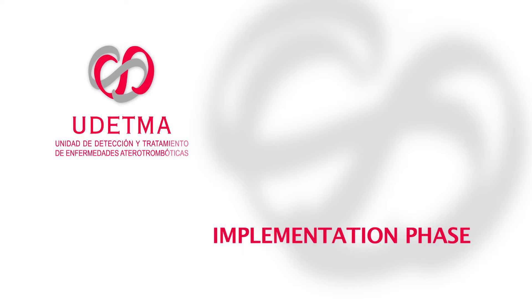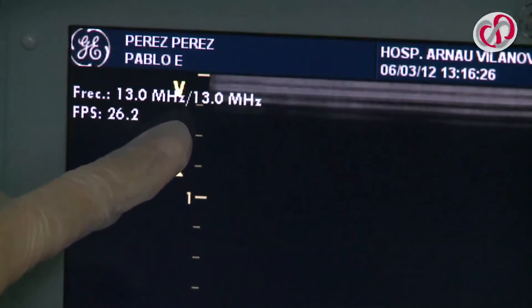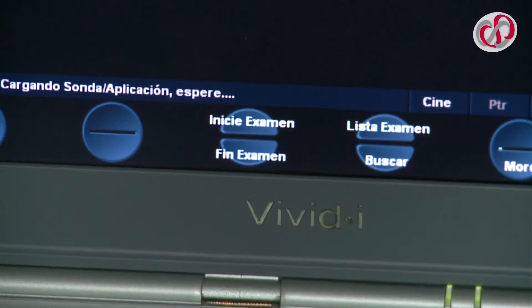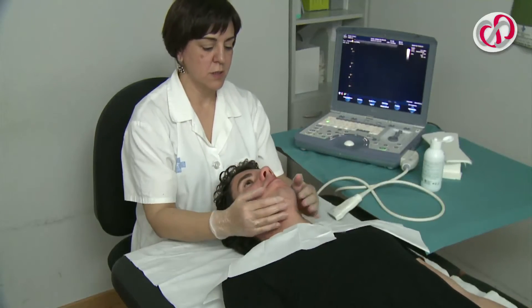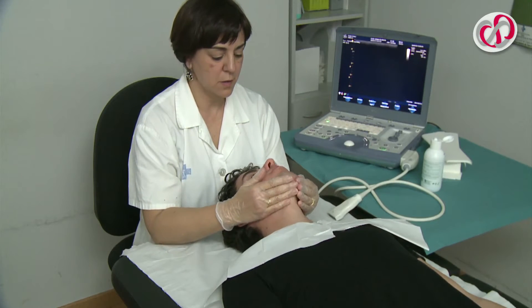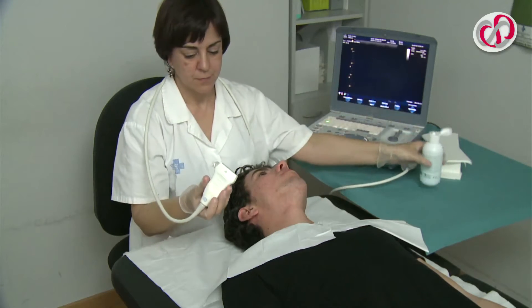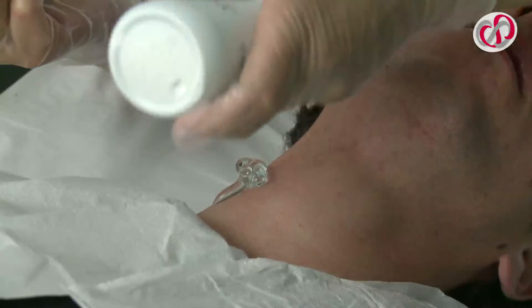Implementation Phase: The notch on the ultrasound corresponds to the V of the screen that indicates the orientation of the image. The technician may be situated beside or behind the patient, either position being correct and depending solely on his or her comfort. The patient is placed with his or her head at a 45-degree angle towards the opposite side to the area to be examined. Conducting gel is extended over the probe and/or over the area to be explored.